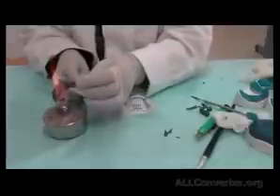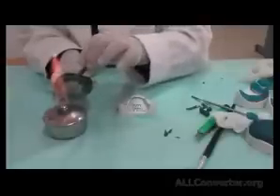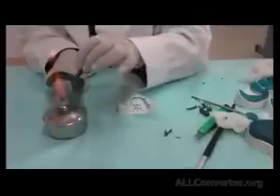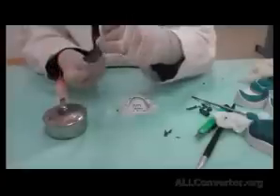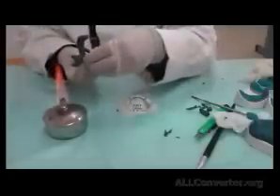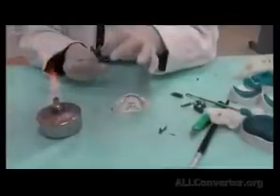This is where the mylohyoid muscle acts, which is the muscle of the base of the mouth, constructing the floor of the mouth. It has glandular tissue, it has the salivary glands in it, so multiple structures. This could easily be molded by asking the patient to move his tongue to the left and right, and then ask the patient to move his tongue posteriorly. So this will border mold this area.